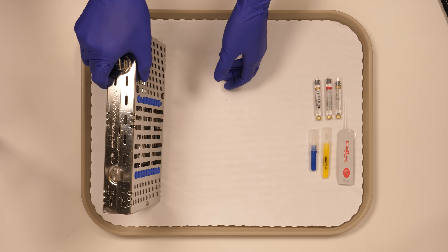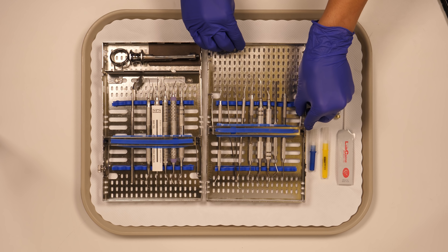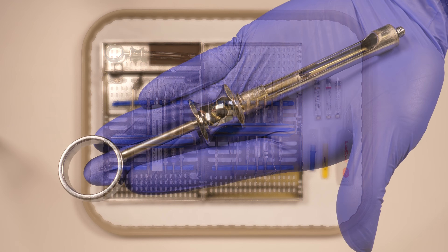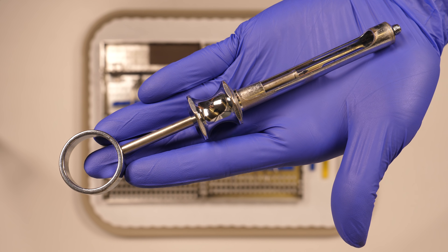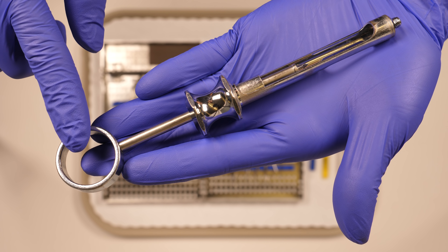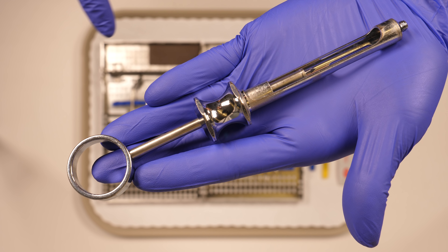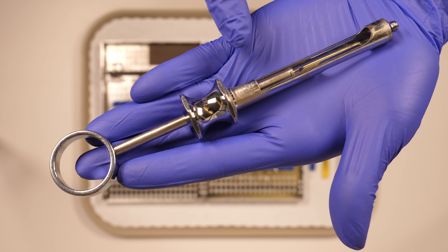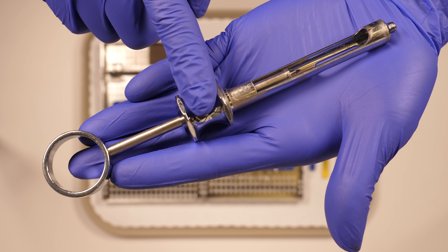Syringe setup is straightforward. Included in most dental cassettes is the metal standard anesthetic syringe. Holding it in your hand, you can see there is an area for your thumb to rest. The thumb rest allows you to aspirate and verify that you are not injecting into a blood vessel. Further down the syringe, there is a finger rest.